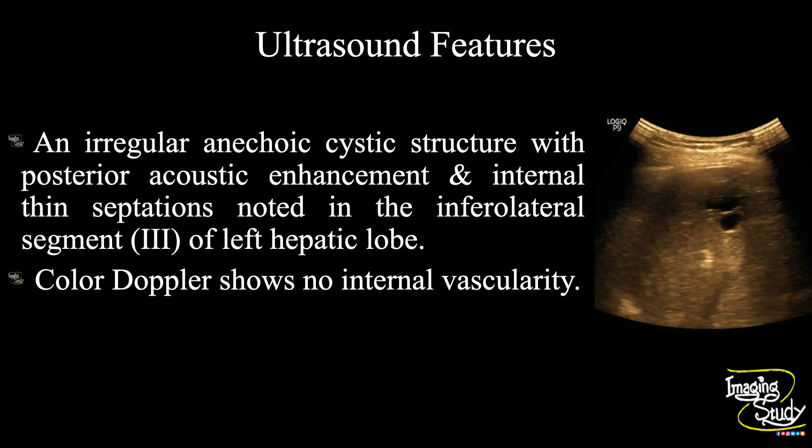In summary, an irregular anechoic cystic structure with posterior acoustic enhancement and internal thin septations is noted in the inferolateral segment, that is segment 3 of the left hepatic lobe. Color Doppler shows no internal vascularity. These features suggest this as a case of complex hepatic cyst.